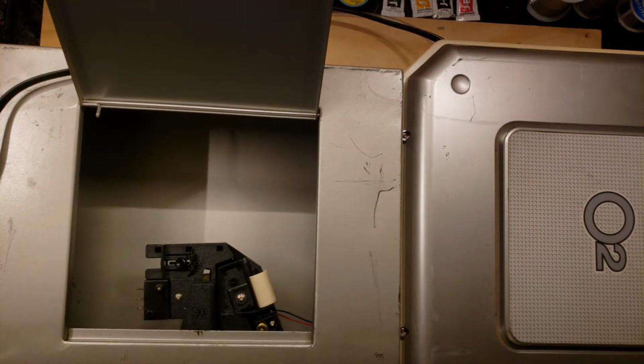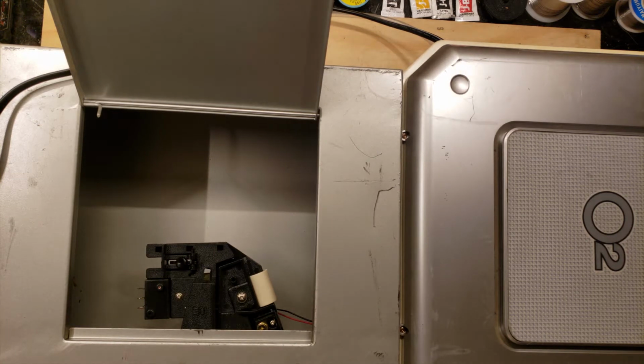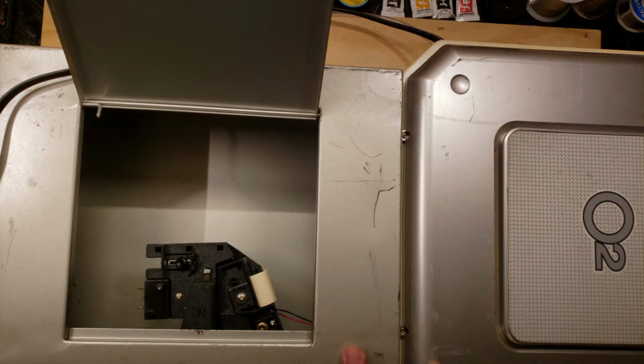My disc is a bit too small, so I'm going to try and attack it in pieces. First, I'm going to try to separate the coin box from the machine, and then I will take a look at them apart.